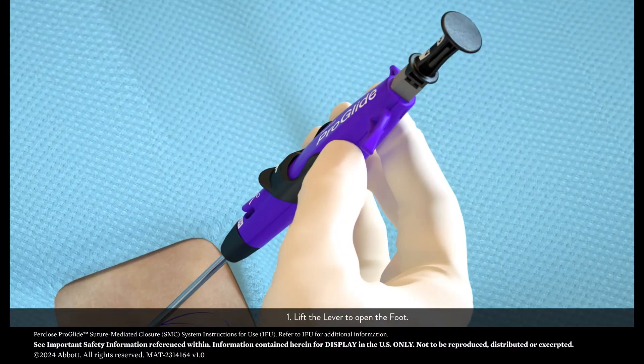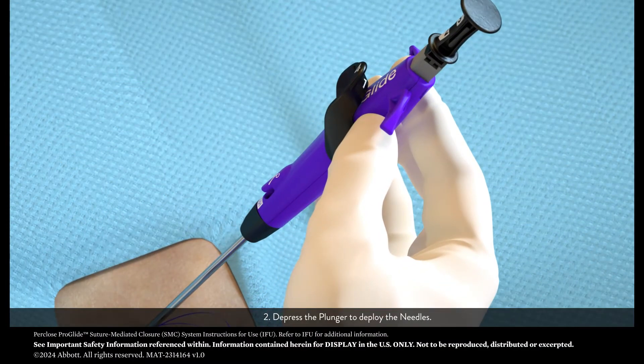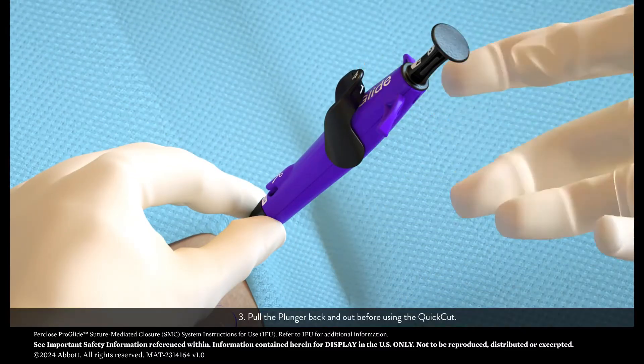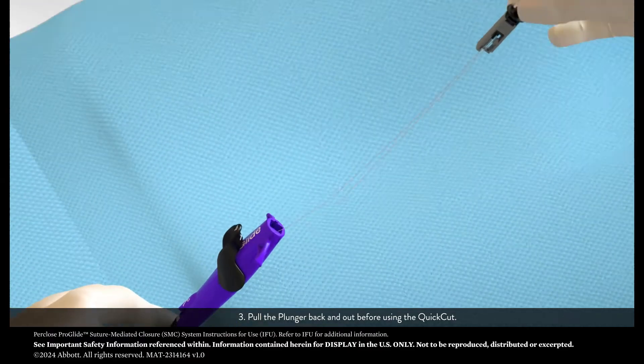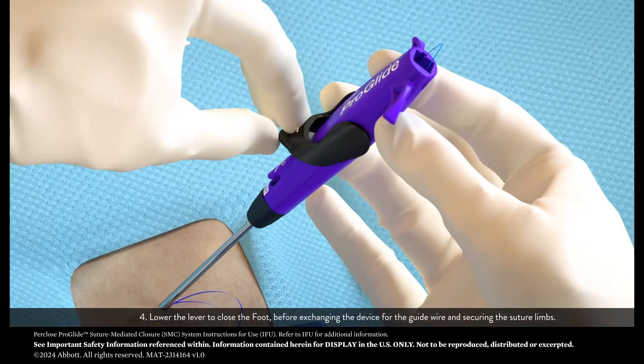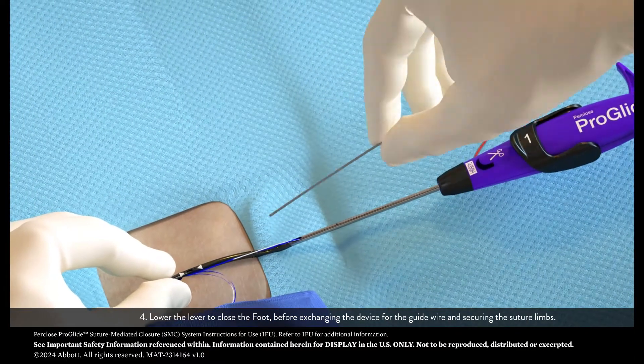Step 1: Lift the lever to open the foot. Step 2: Depress the plunger to deploy the needles. Step 3: Pull the plunger back and out before using the quick cut. Step 4: Lower the lever to close the foot before exchanging the device for the guide wire and securing the suture limbs.